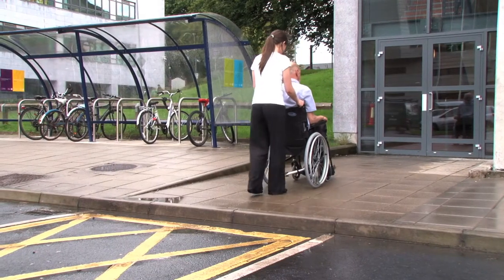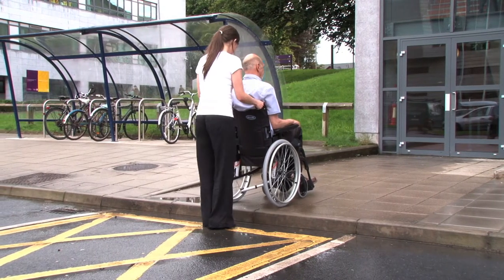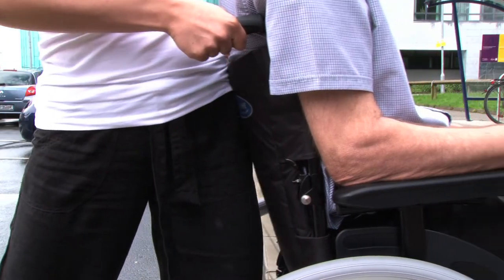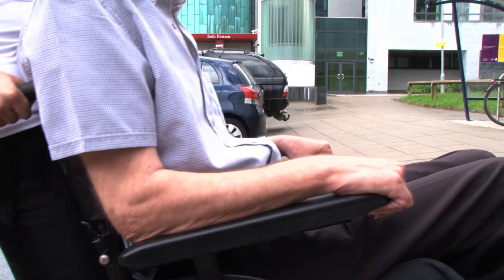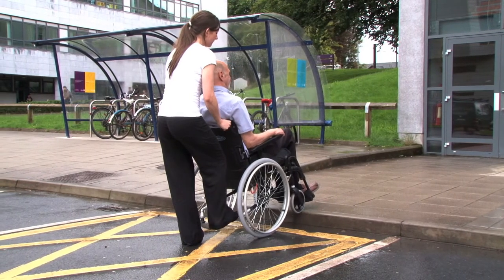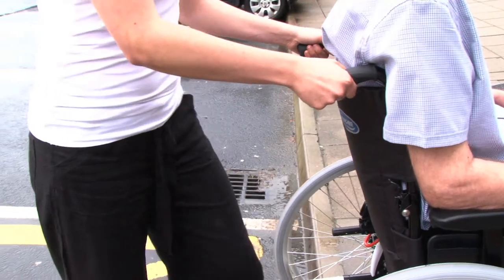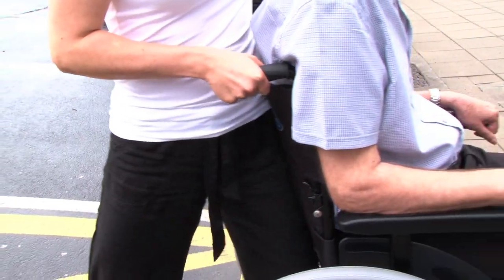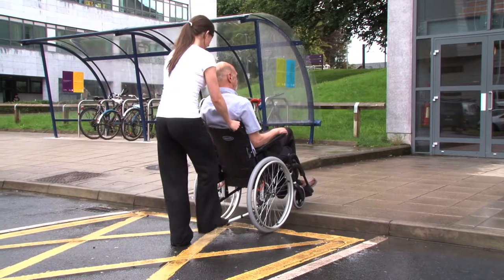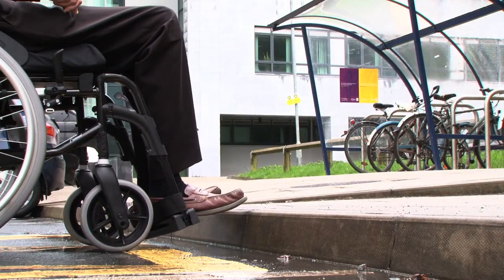To go down a kerb, reverse the wheelchair so that the larger wheels are at the edge of the kerb. Standing behind the chair with their body close to the backrest, the caregiver guides the wheels gently down the kerb. Once the larger wheels are on the lower surface, the tipping lever can raise the front wheels so they clear the kerb as the chair moves. The front wheels can then be gently lowered onto the lower surface by controlling the movement with the tipping lever.